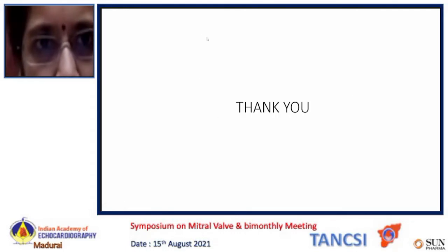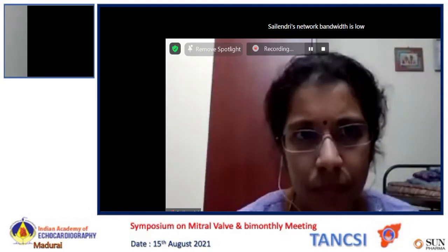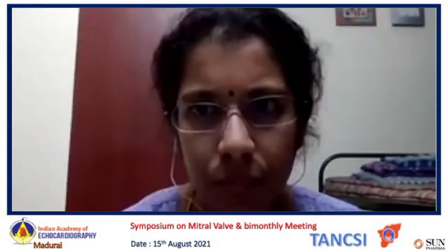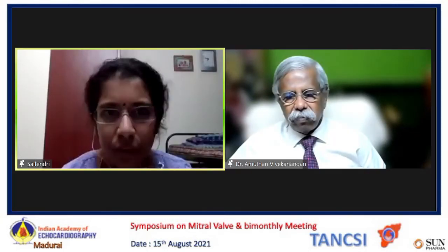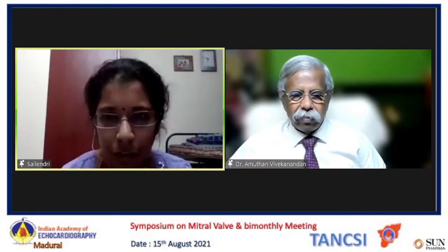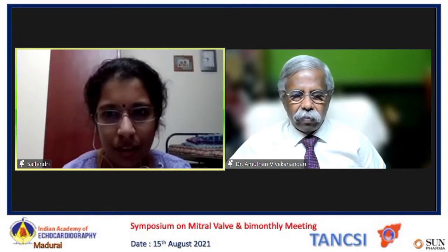What was the echocardiographic appearance of the aortic valve post-treatment? Sir, he continued to have the severe eccentric aortic regurgitation, sir, with the mass seen attached to the valve.